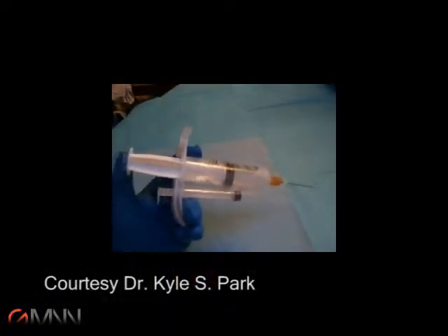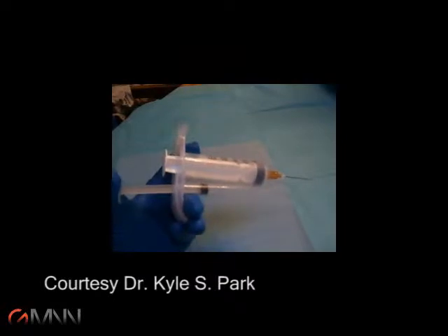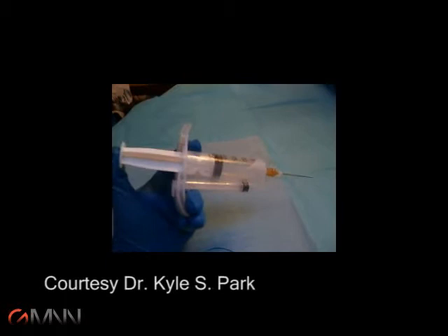It shows a rheumatologist performing an interarticular procedure with a novel injection device that uses a two-barrel syringe, known as the reciprocating procedure device. The benefit of this device is that a physician can hold it in one hand and an ultrasound transducer in the other and perform a procedure without the need of a second physician.